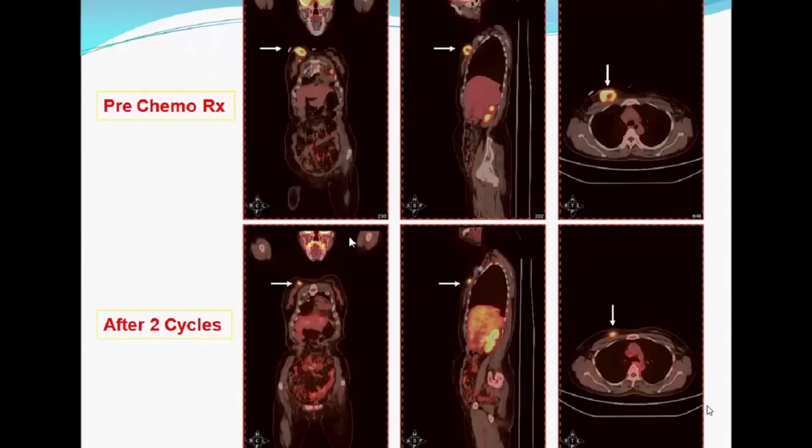Here in assessment, pre-chemo, what is the status, see the lesion, and post-chemo, how easily it is showing benefit. It is very clearly displaying that the lesion has reduced significantly. This chemotherapy is effective. If the size was not reduced, then the clinician has an option to change the chemotherapy drug. So that way, assessment of whether the chemotherapy is effective or not is easily possible, and PET CT is giving a very important contribution.